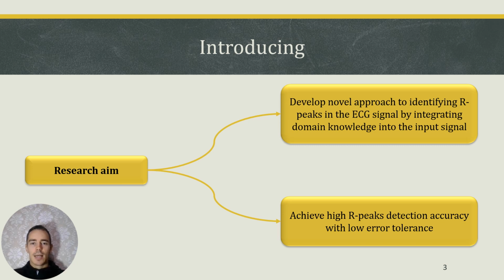In medical practice, the electrocardiogram is an effective tool for identifying heart issues like irregular heartbeats, arrhythmia, etc. R-peak detection is a crucial step in the analysis of the electrocardiogram signal. There are many R-peak detection methods and approaches with reported high statistical results, but Poor and McFarlane performed an analysis of R-peak detection methods and discovered that in most cases, high results were achieved using a large time tolerance, possibly 100 milliseconds or even more. For example, the duration of a normal QRS complex is 100 milliseconds.